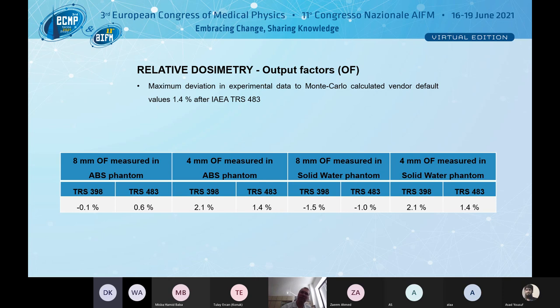Scintillation detector is the new kind of detector, which is supposed to be a good one. And as far as I know, the MOSFET was also used for measurements. Tiny little TLD rods or small alanine dosimeters, I'm not sure. I think this is rather post-hoc dosimetry, so we should use some system which we can immediately evaluate in our center. As for TLD and alanine, it's probably very difficult to make such small chips. So that would be it.